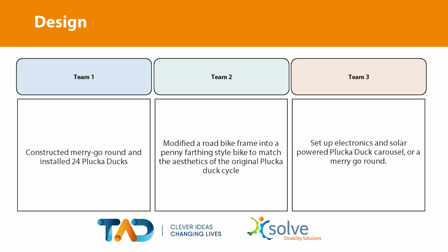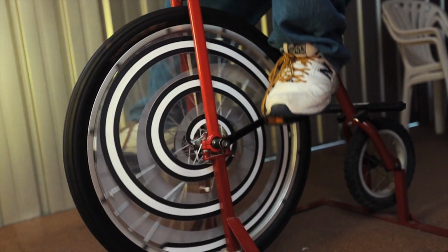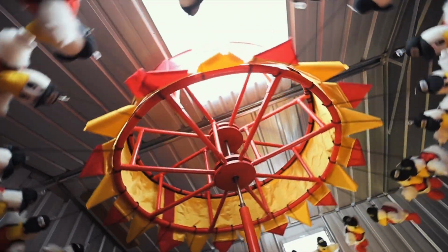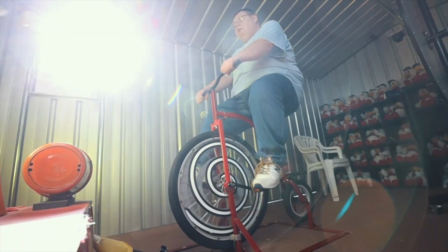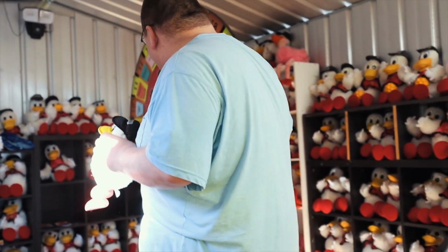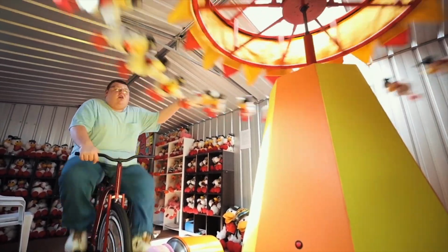The carousel has a solar panel that generates energy using the Hall effect principles to spin the carousel when Chris pedals. So in order to operate the motion of the carousel with the duck spinning as a visual feedback, Chris must pedal very hard to work on his muscles and energy. This exercise will also build up his endurance and prepare him for outdoor cycling.